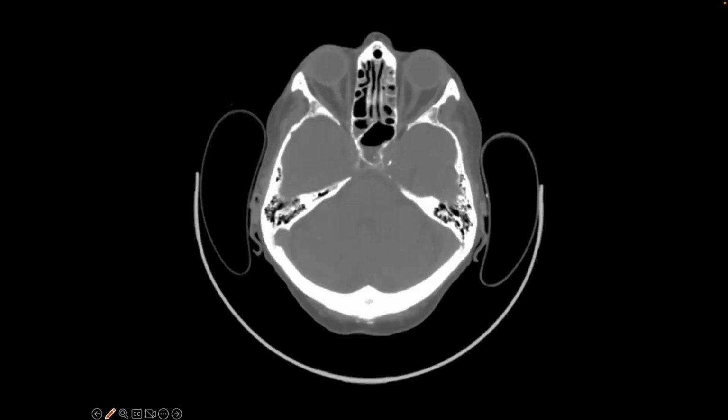As we move along here, I have really good edge data. These are obviously back projecting this way, because perpendicular to this line I have really good information about where this edge is and where that edge is.